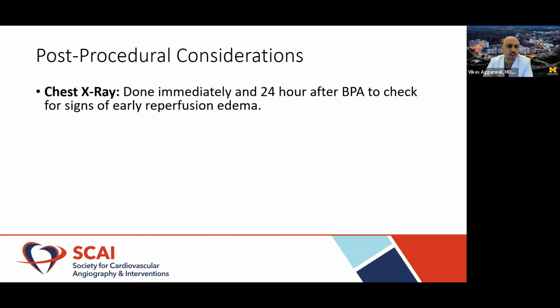Post-procedure considerations: in my practice, I do a chest x-ray right after the case and then 24 hours after, just in an attempt to identify early reperfusion edema. I have not seen a lot of reperfusion edema in my practice.